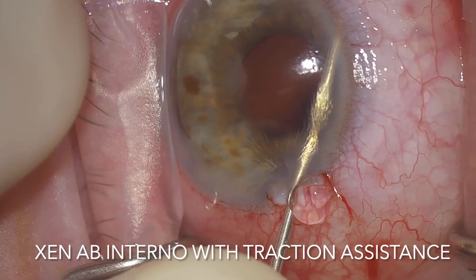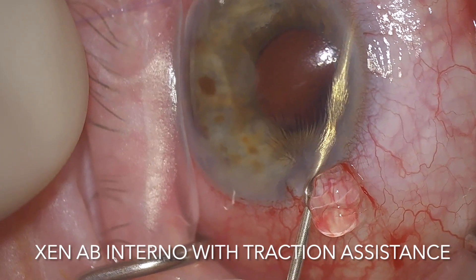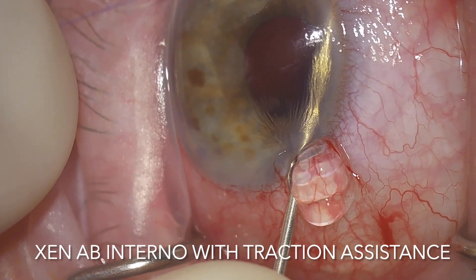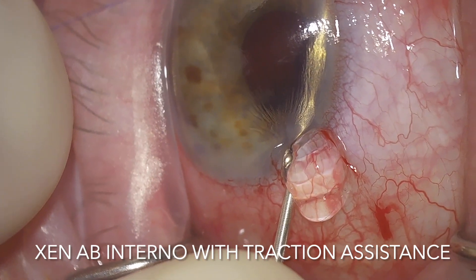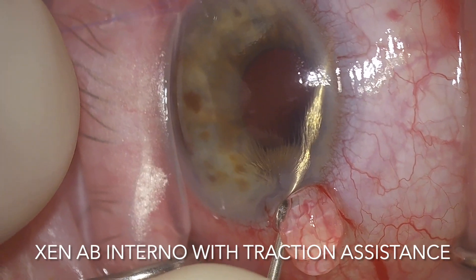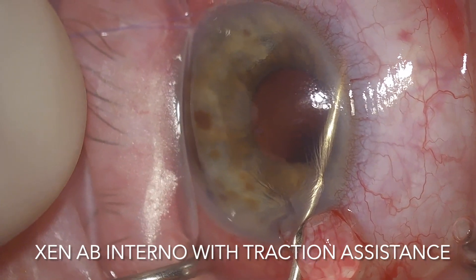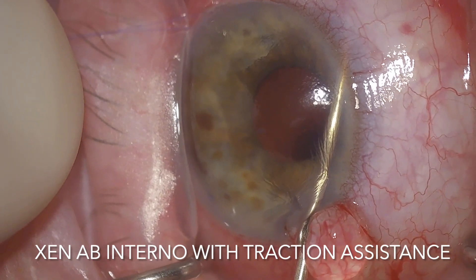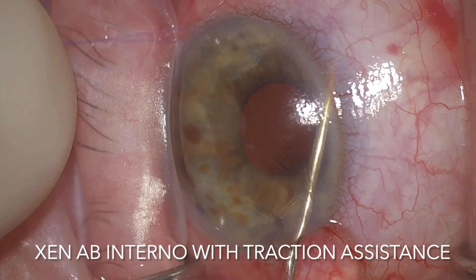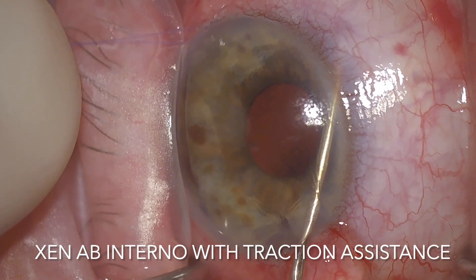Here we're going through the angle with the Xen. I'm targeting the subconjunctival space right below the conjunctival vessels. I have compressed the lidocaine-mitomycin mix to help reduce any conjunctival edema to pass through the tenons. Unfortunately the video is just cutting off the tip, but right now the tip is placing the Xen in the subconjunctival space and it's being retracted. As soon as I'm happy with the Xen being released, I can come and remove my injector from the eye.